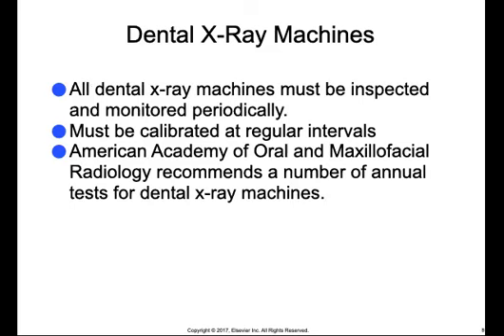So all the dental x-ray machines must be inspected and monitored periodically. They also must be calibrated at regular intervals. And it is the American Academy of Oral and Maxillofacial Radiology that recommends a number of annual tests for dental x-ray machines.